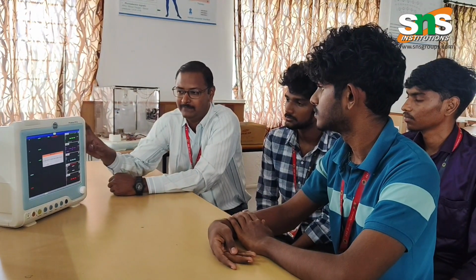In this video we are going to discuss the patient monitoring system in a design thinking approach. I have a few of my third year biomedical engineering students along with me for this explanation. Here we have an RMS patient monitoring system which we will operate in demo mode, and it has 5 parameters which can be observed 24/7, available in the critical care unit of every hospital. The first process will be explained by Dharnidharan of 3rd BME.